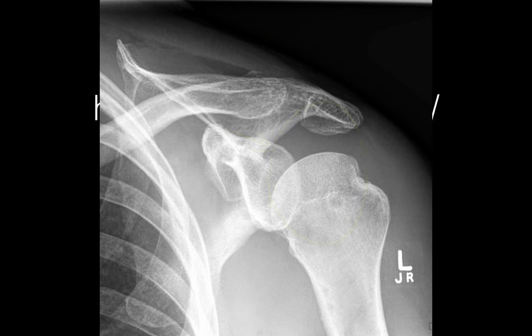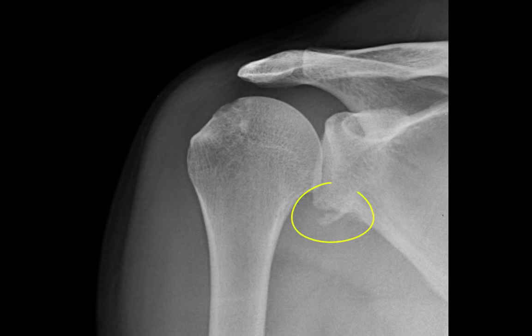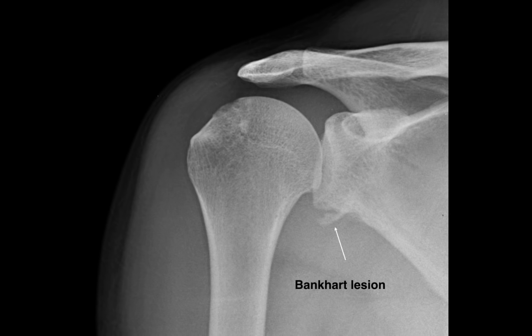Here's a dislocated shoulder that's been reduced, so the humeral head is back in the glenoid fossa, but there's a bony lesion. This little divot in the posterior lateral aspect of the humeral head is known as a Hill-Sachs deformity — a compression fracture sustained as the humeral head pops out of the shoulder joint. Another type of bony lesion is called a Bankart lesion, where there's an avulsion of a bony fragment from the glenoid fossa. Both a Hill-Sachs deformity and a Bankart lesion have prognostic implications, so it's really important to look for them after a dislocation has been reduced.